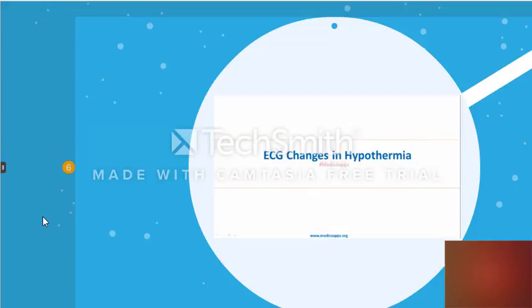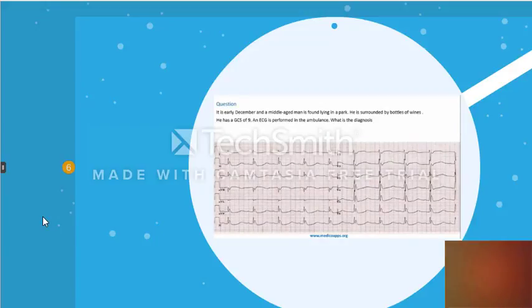One of the questions asked in ECG was about changes in hypothermia. So let's look at the changes via the question which was asked. In early December, a middle-aged man is found lying in the park. He is surrounded by bottles of wine, has a GCS of 9, and an ECG is performed in the ambulance. What is the diagnosis? And the options were these.